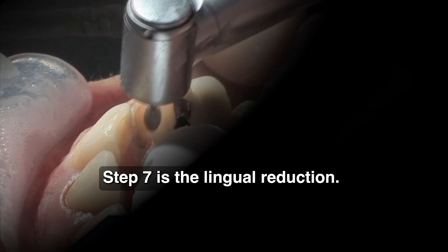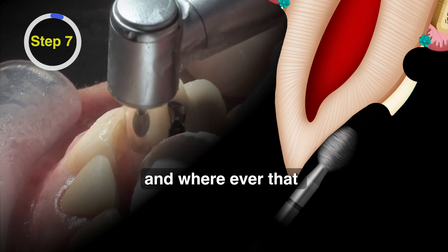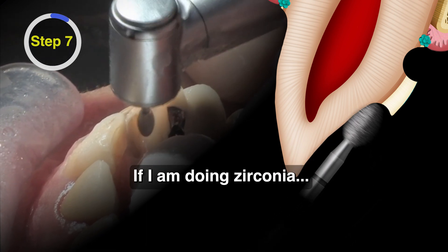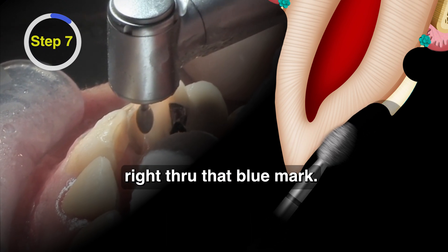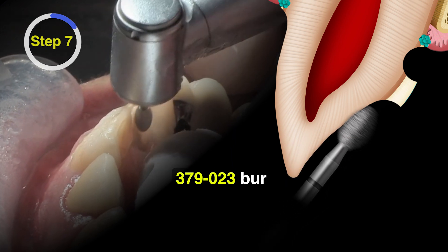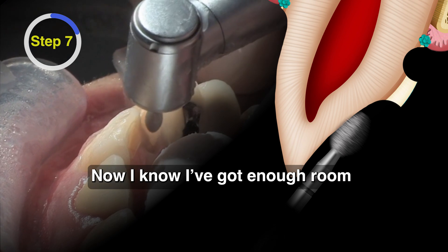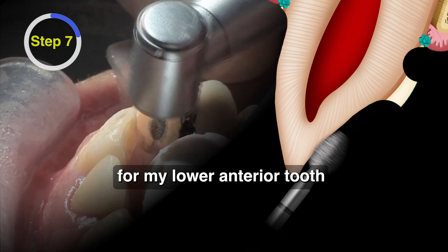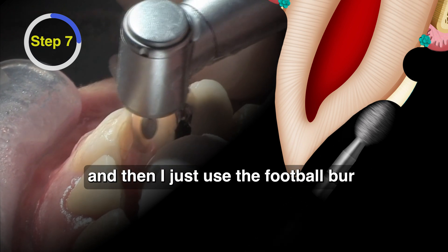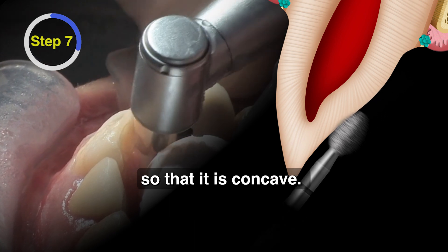Step seven is the lingual reduction. I'll usually mark this with a piece of articulating tape, and wherever that lower anterior tooth is hitting, if I'm doing zirconia, I'll put a 0.6 millimeter depth cut right through that blue mark. If it's eMax, I'll put a one millimeter one, and then I'll use this 379023 bur to make sure that depth cut disappears. I prep all that away and now I know I've got enough room for my lower anterior tooth and enough strength for my material. Then I use the football bur to blend that depth cut with the rest of the lingual surface so that it's concave.